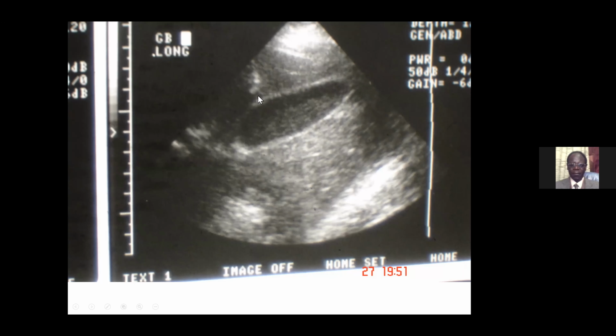This is the liver again, gallbladder with a thickened wall, and the wall here is thickened and actually calcified. That is a sign of chronic cholecystitis. And what we see next, bile is supposed to be uniform. Where there is inflammation, among other things, there's loss of function.